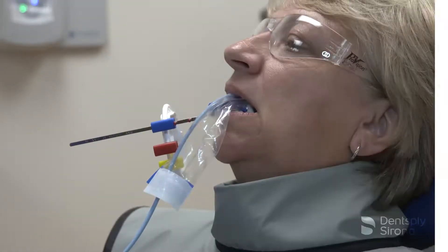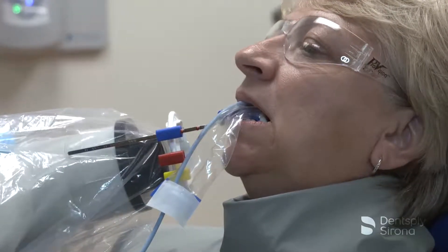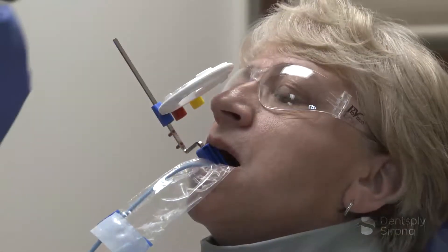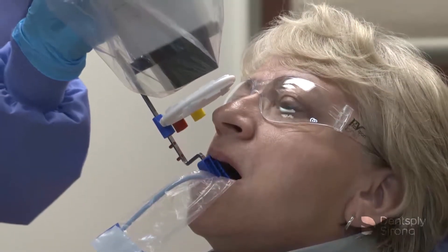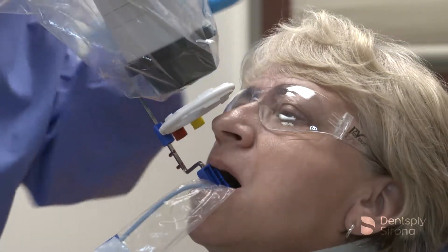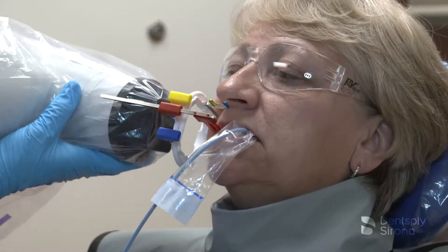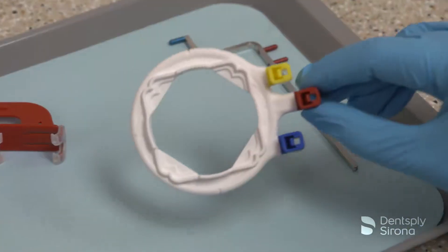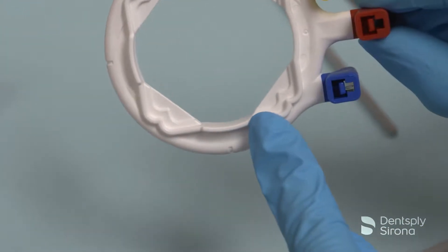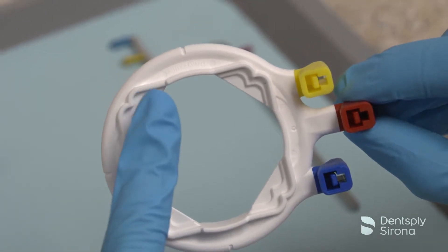To take an x-ray using the universal collimator, bring the PID into alignment with the image receptor holder and aiming ring being utilized. In this demonstration, the clinician is utilizing the RIN universal collimator with the XCP DS-Fit universal sensor holder with the XCP Aura arm and ring to align the PID for accurate imaging. The XCP Aura ring has built-in raised tabs which stop tube head drift and is ideal for use with rectangular collimators.